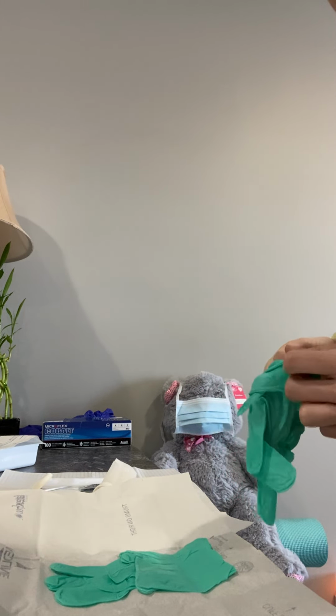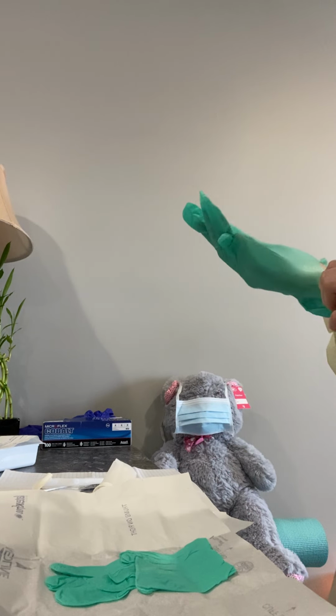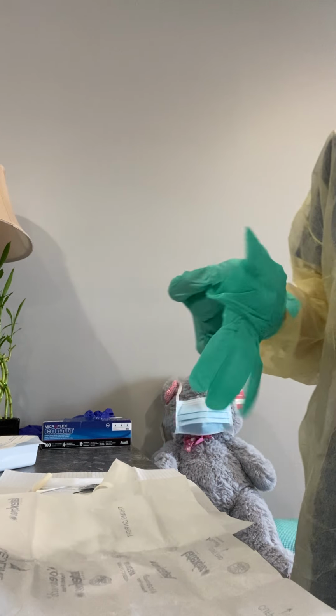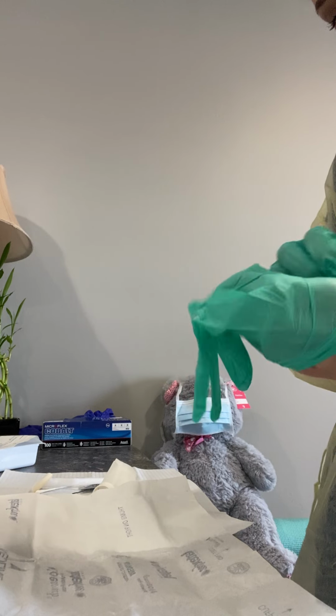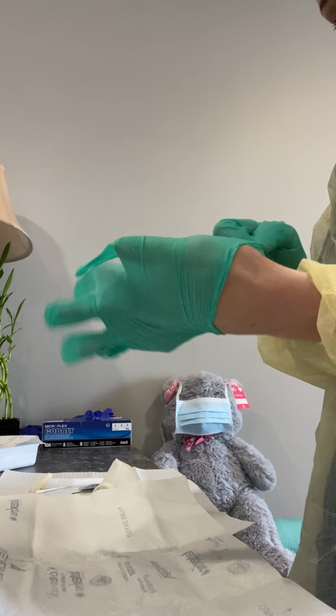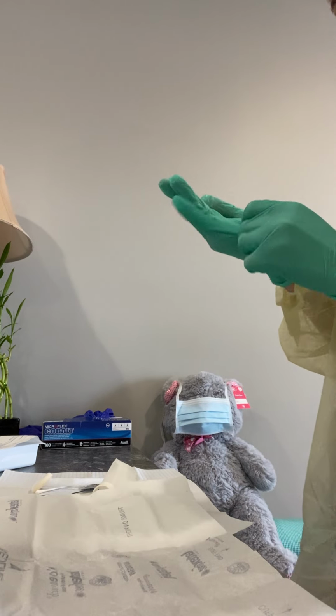I think my hands might be a little too big for these guys. Okay, so I've got my sterile gloves on.